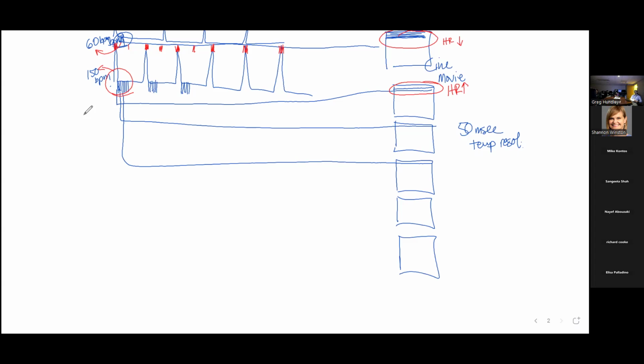Everybody get that? So when you get a blurry image, the first thing to check is, are you getting the triggers appropriately collected? Are they registering with the QRS complex? And number 2, do you have the amount of lines you're capturing per frame set correctly for the heart rate? Those are the adjustments you need to be able to make.